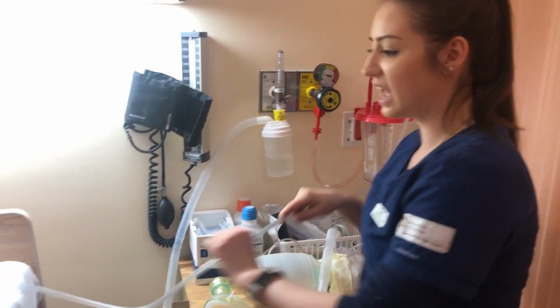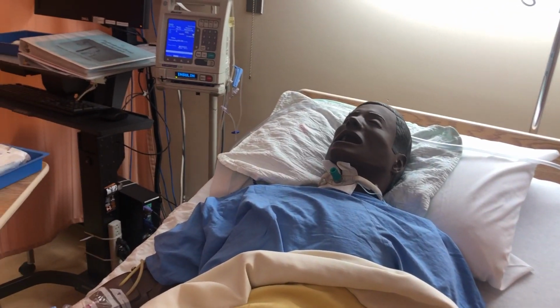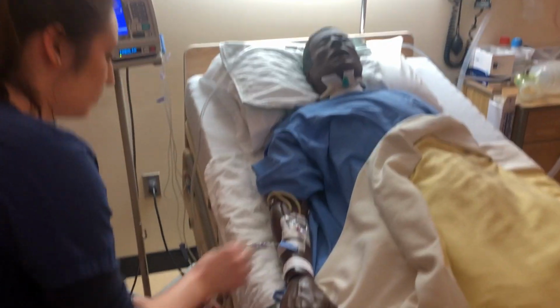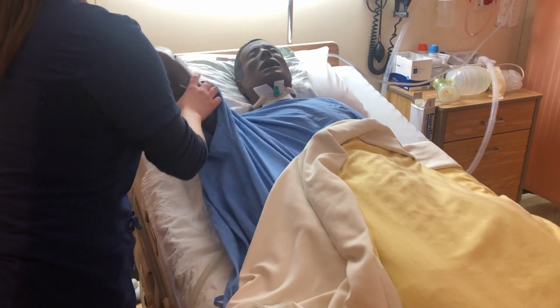I'm going to follow the line all the way to the drainage system. So I'm just following it. I'm making sure there's no kinks in the line. Same with over here. So we're just going to get your arm up.